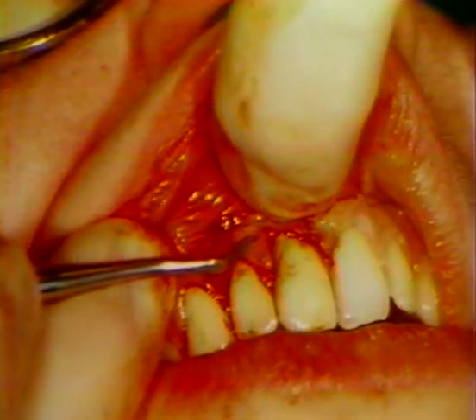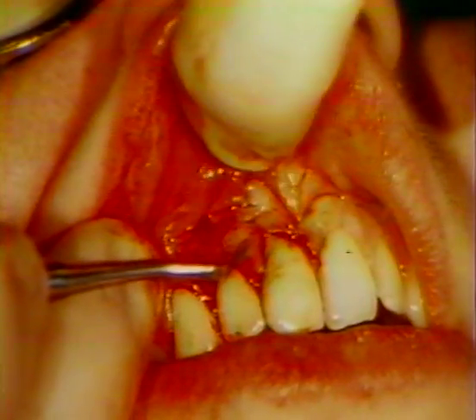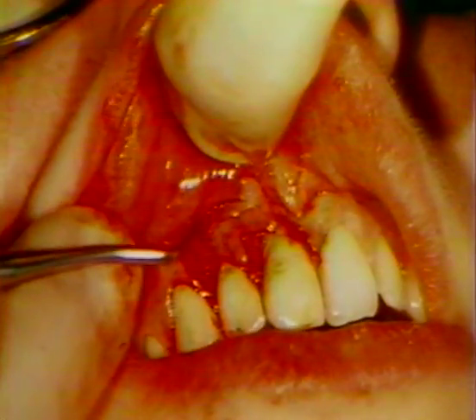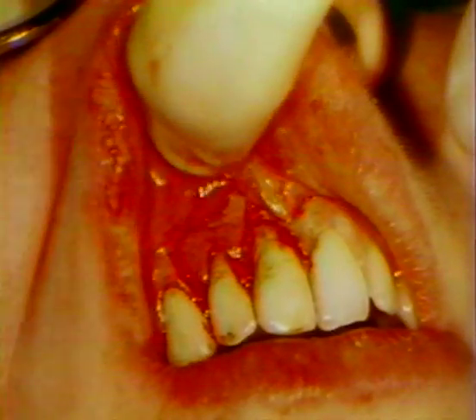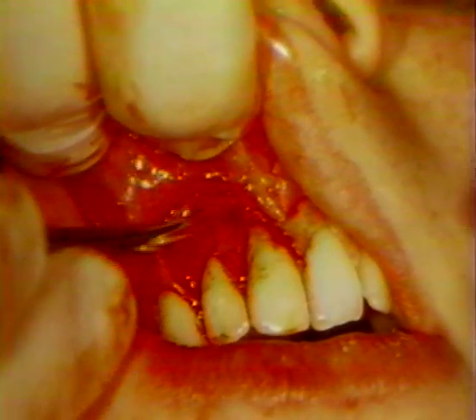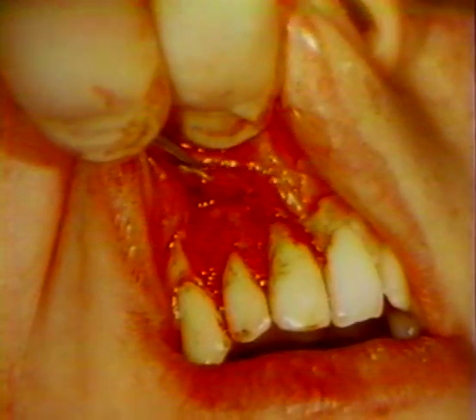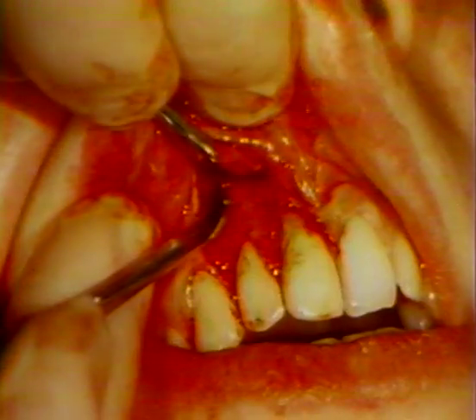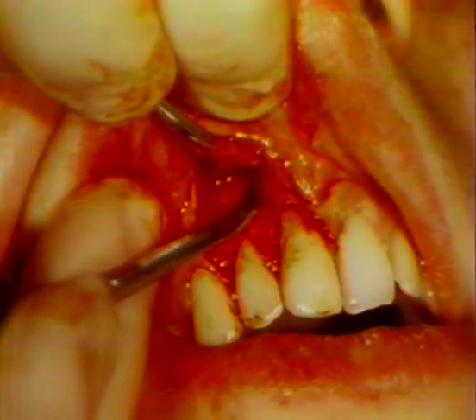As the flap is moved toward the central incisor, slight resistance is encountered, indicating tissue tension. Therefore, it is necessary to extend the releasing incision at the distal aspect of the flap. The incision is carried through the periosteum to facilitate the flap adaptation.